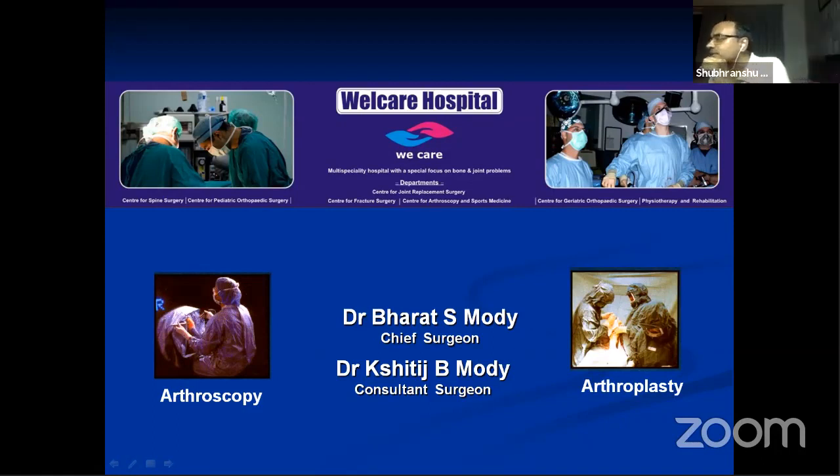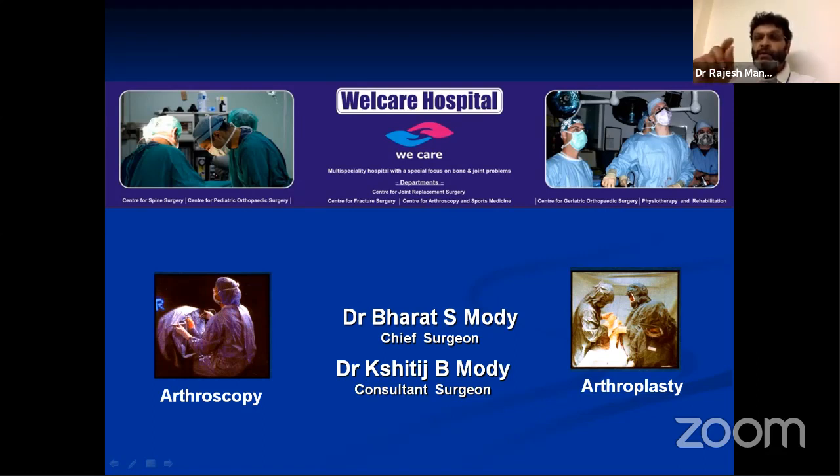One more question to you: is there any planovalgus foot, and in those cases, do you change your implant alignment to accommodate the foot deformity? I think it's a very good question, but I don't have a very concrete understanding of this at the moment, but I would definitely look at it. There are some patients I send to my foot colleague to evaluate first. At the moment, the consensus is that if the foot deformity is correctable, I would just go ahead and do my normal orientation to the center of the ankle, or maybe a little bit more towards the lateral side, that means in valgus, and then see over the next 6 months whether they accommodate or correct or not.